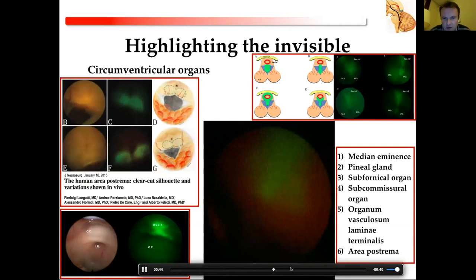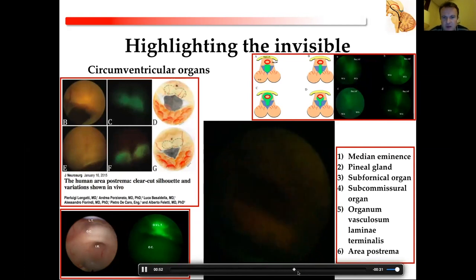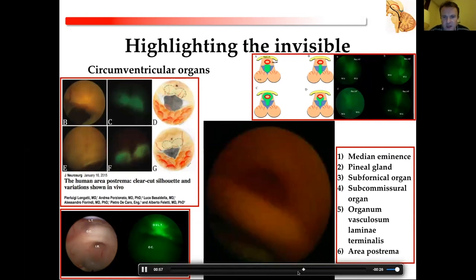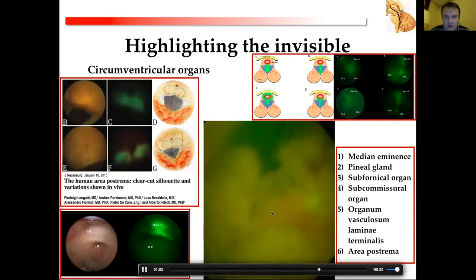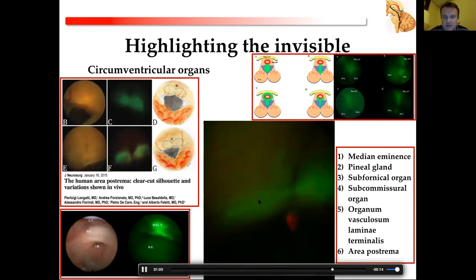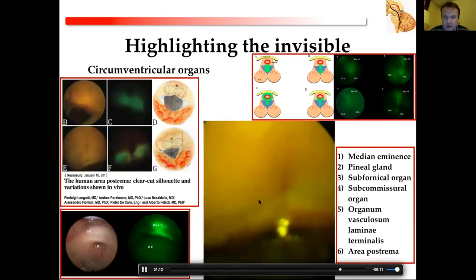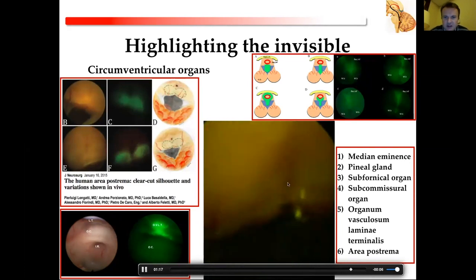And beyond the pillars of Hercules, actually, so in the fourth ventricle, we can also see a circumventricular organ, which is located in the inferior triangle of the fourth ventricle. Here we are entering the fourth ventricle, choroid plexus of the fourth ventricle. And now with fluorescent mode, you can see these two leaves. This is the area postrema of the fourth ventricle, which is not possible to see with normal light. This is the canalis centralis medullaris.